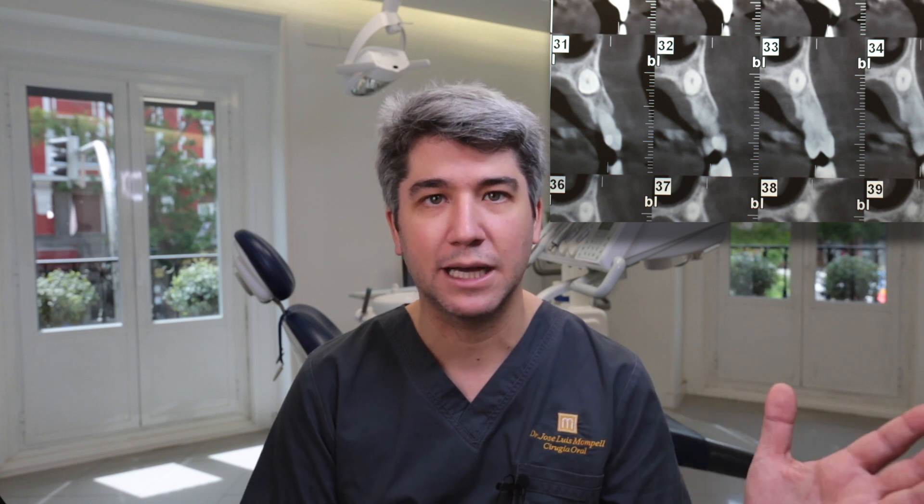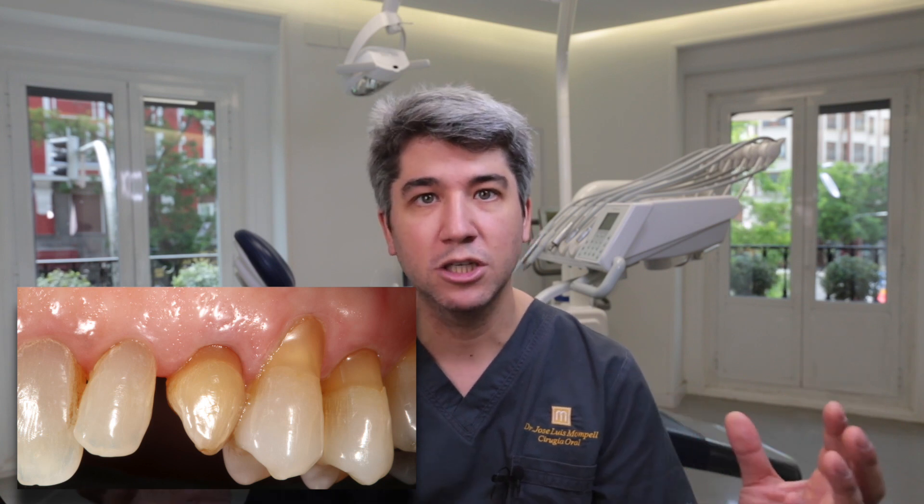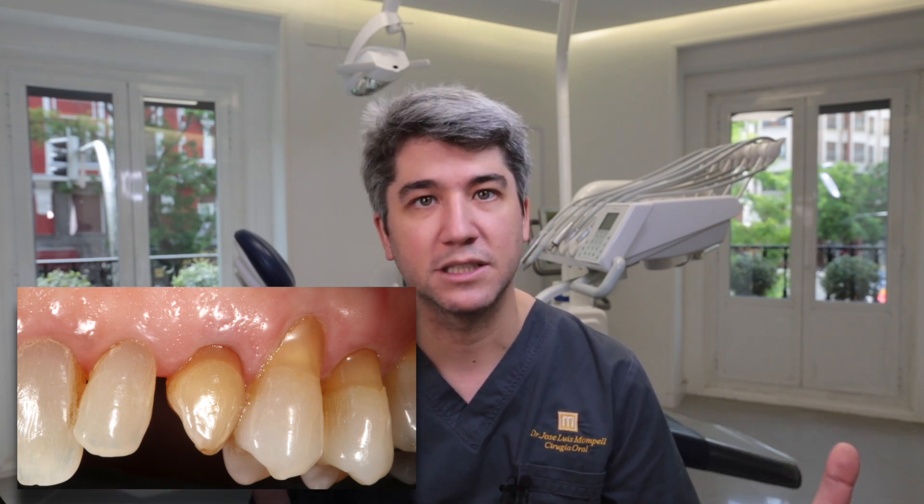First of all, we need an x-ray — we need a CBCT. We need to make a good diagnosis in order to see if the canine is on the palatal side or the buccal side. Every single time we face a patient around 18–19 years old and we see that the permanent canine is not in the arch, we need to do this x-ray.